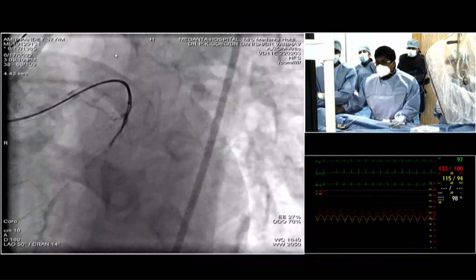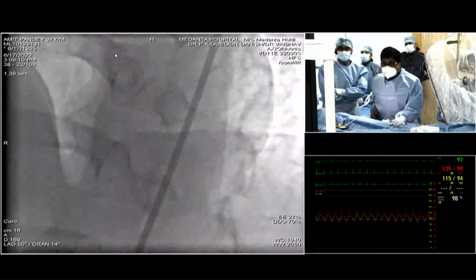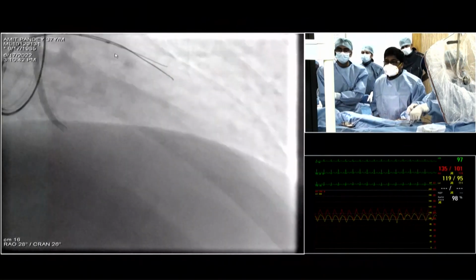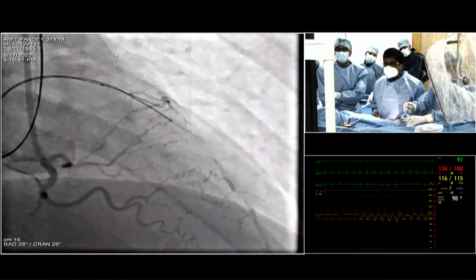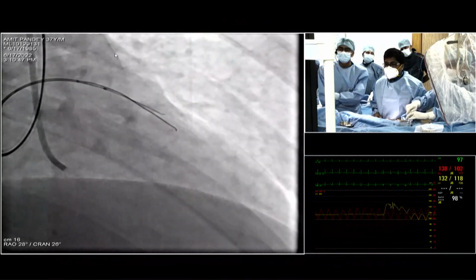So Dr. Goel, where can I go back and show us what you did? I feel you have probably reached inside. Let me just do a little more injection, please. Thank you. Right injection, please. Now you see, this is the importance of the contralateral.